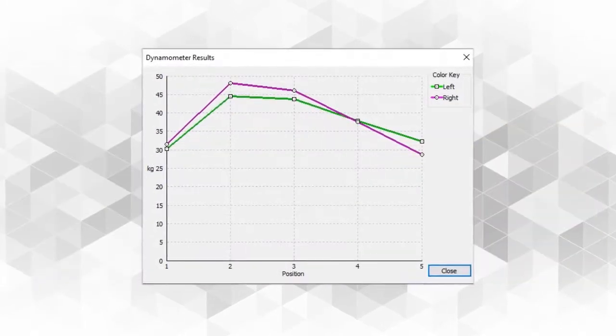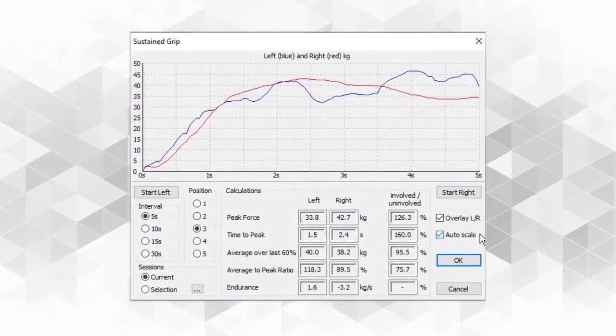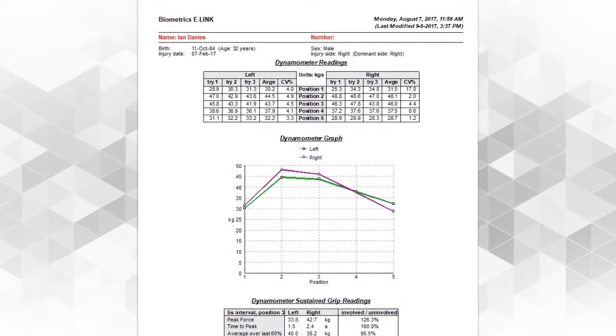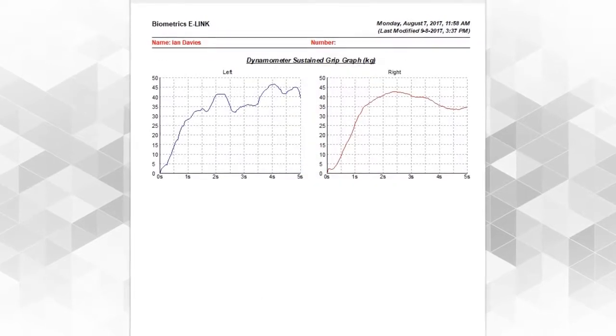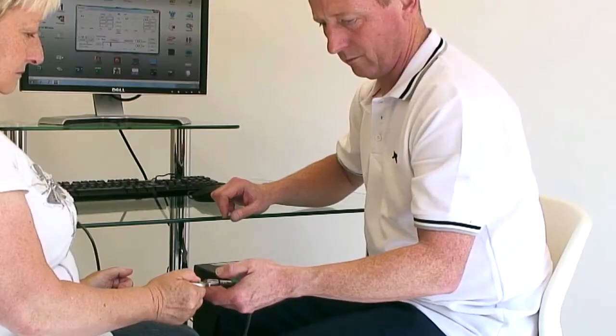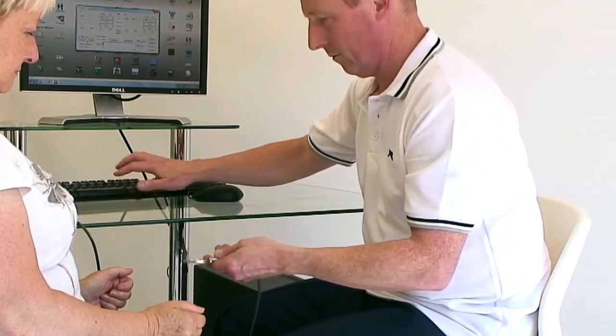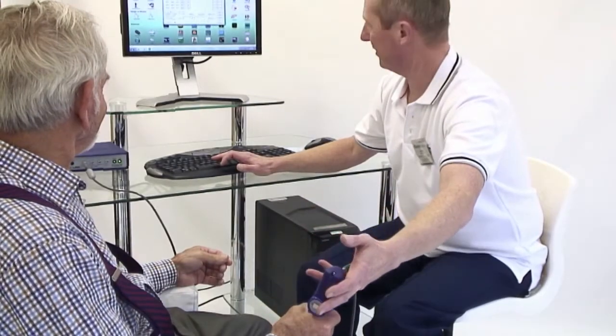The hand kit is the ideal module to quantify and monitor the effectiveness of various interventions for the upper extremity throughout the whole rehabilitation process, even in the earliest stage or for weak patients with chronic debilitating conditions.